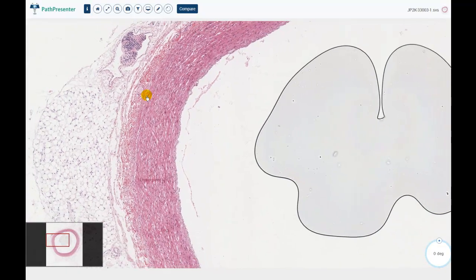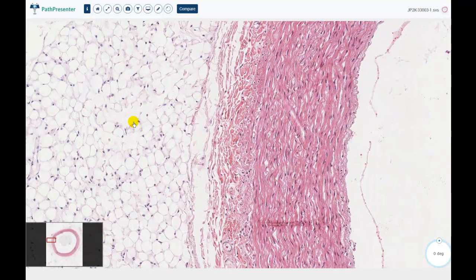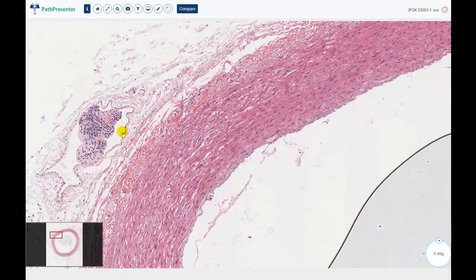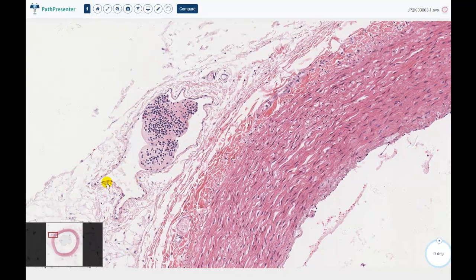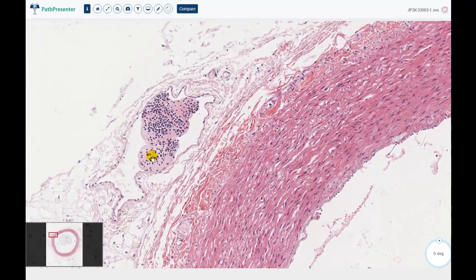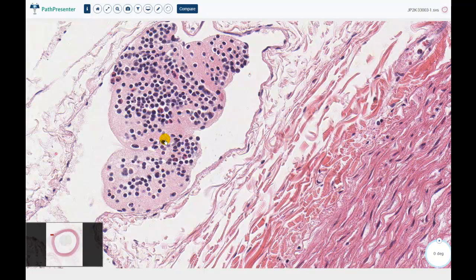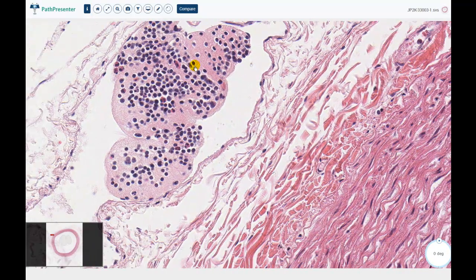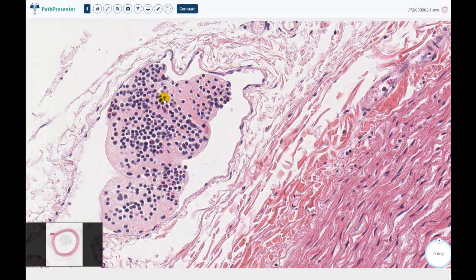So the other observation I made, of course, is the adipose tissue on either side. But of interest is this lymphatic. And you see this lymphatic is very irregular because it's very thin-walled. It conducts lymph, but also conducts lymphocytes. And these lymphocytes here are congealed into what might be fibrin. I'm not sure, but they are definitely lymphocytes. And as a matter of fact, there are a few eosinophils that are trapped within this congealed mass within the lymphatic.